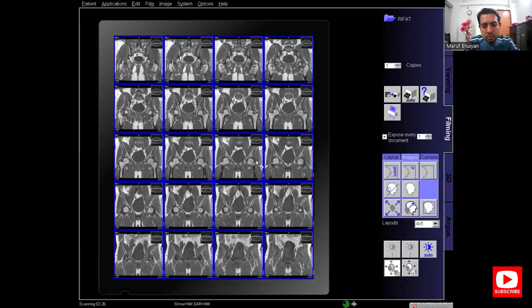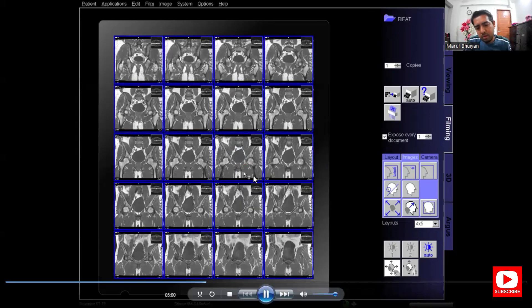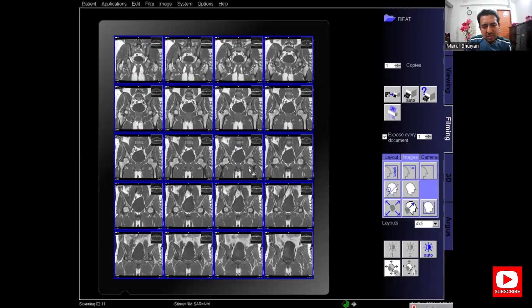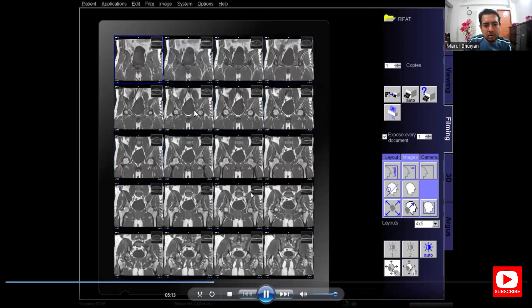Adjust the window and reverse the series for correct order. Select the series and then reverse the series — now the images are in correct order. This is from the anterior side, then there is the bladder and the symphysis pubis, and this is the posterior image.